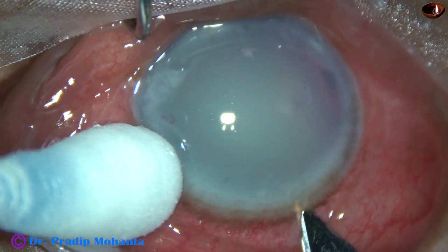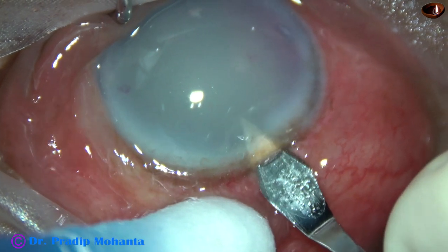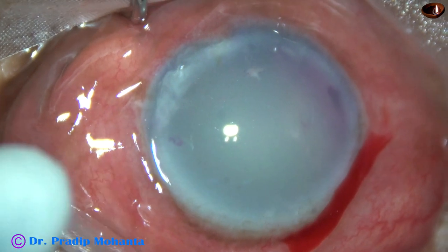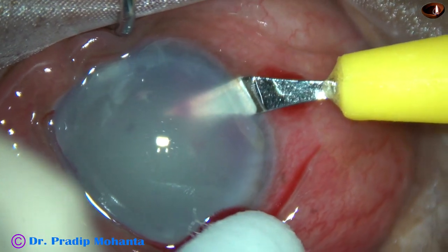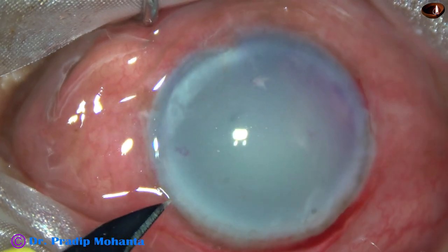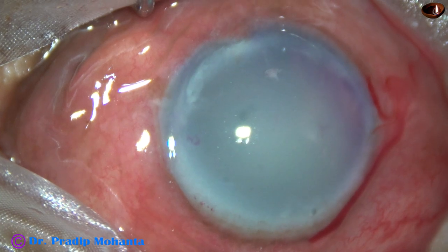This is the main incision on the posterior aspect of the limbus with a 2.8 mm steel keratome. This is a side port on the right side of the main incision, about 3 clock hours away. And this is another side port on the left side of the main incision, about 2.5 clock hours away.